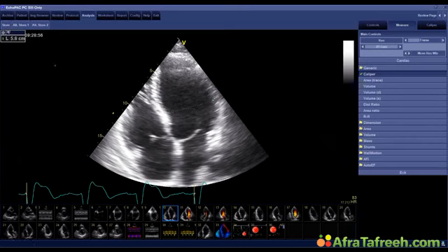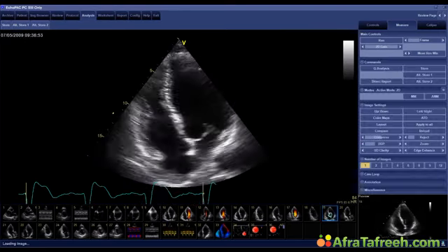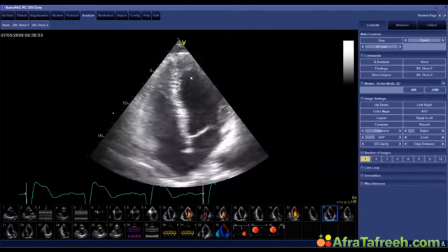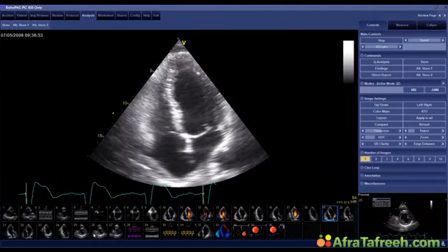Okay, so somewhere in the range of 56. Now it's a bit larger than what we had before. Not very much larger, but if we performed calculations of the volume, we started to notice that his ventricle was just slightly getting larger. Okay, another 4-chamber view to help you appreciate left ventricular function.